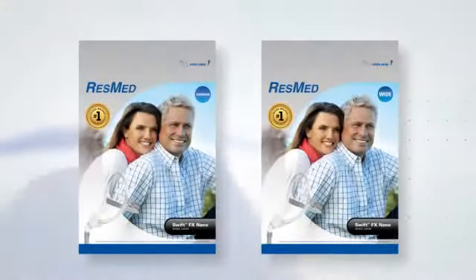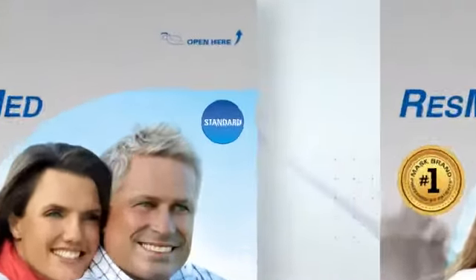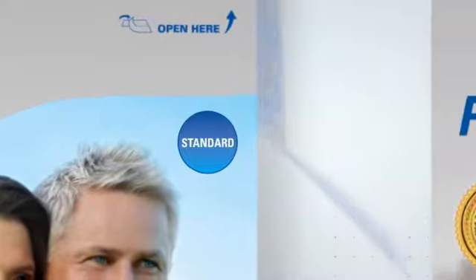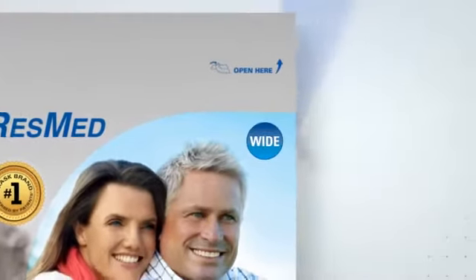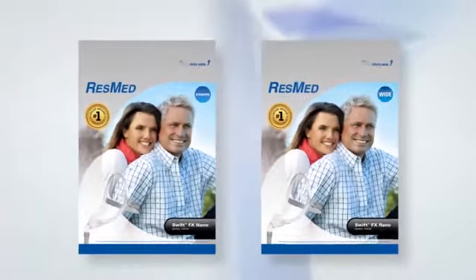The Swift FX Nano comes in standard or wide sizes. If the cushion that came with your Nano isn't fitting well, you may have the wrong size. Consult with your physician who will review the sizing of your mask, or your home medical supplier who can correctly size your face.